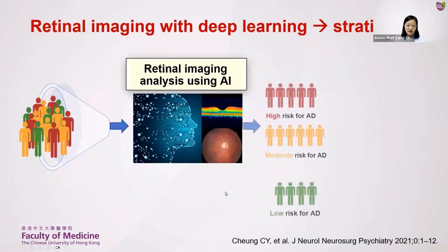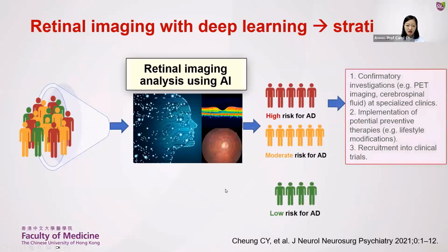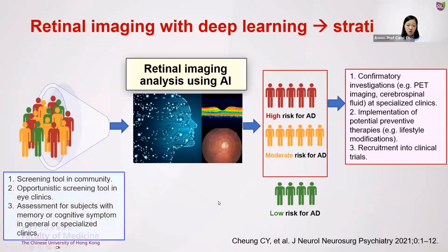We believe that classification of AD based on retinal imaging could leverage existing community eye care infrastructure, for example, optometry networks that enable opportunistic AD screening during routine examination and screening for common eye diseases. For example, deep learning algorithms are already in use for community DR screening in Singapore.